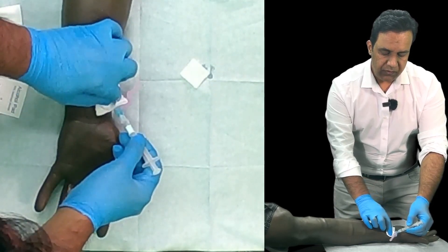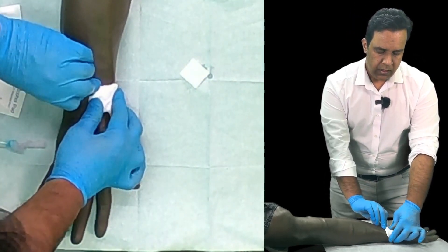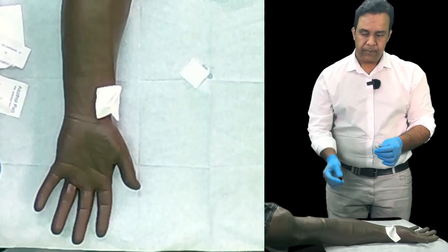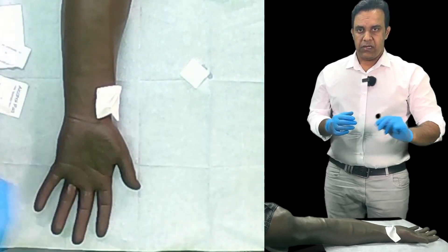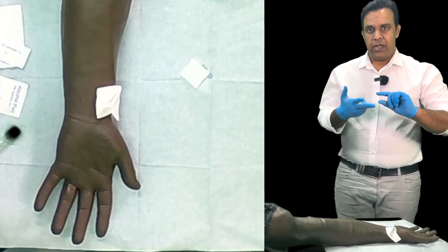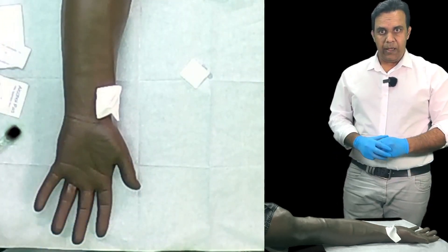Take a gauze piece, remove the needle gently, apply pressure, and press the lock to close the needle. Put tape over the site and warn the patient that if they see any bleeding they should let the nurse know. Remove the needle and dispose of it in the sharps bin. Remove any air from the syringe, put the cap on, shake it well, then take it to the machine with the patient's name, date of birth, temperature, and oxygen level. Insert the information, process the sample, and treat the patient accordingly.